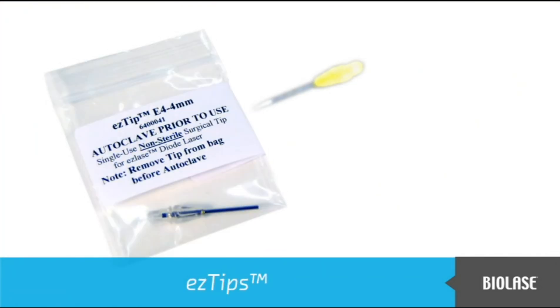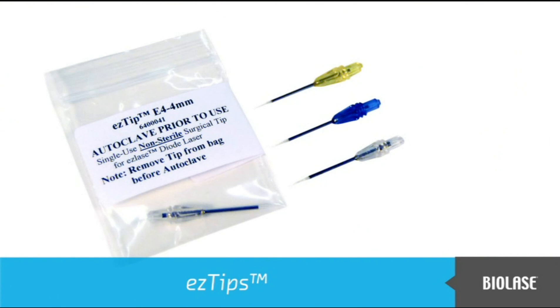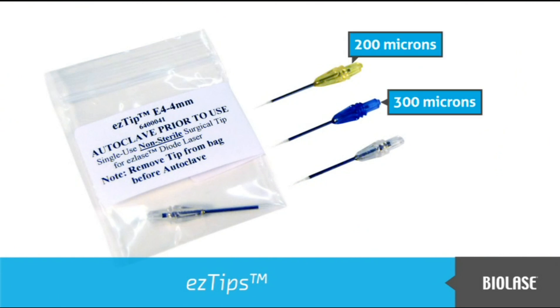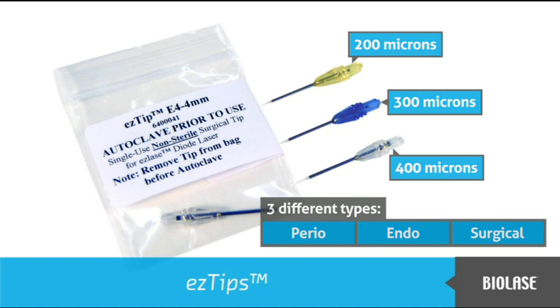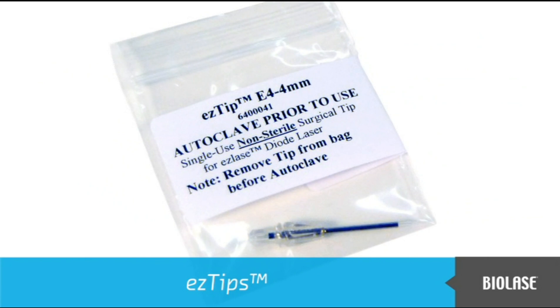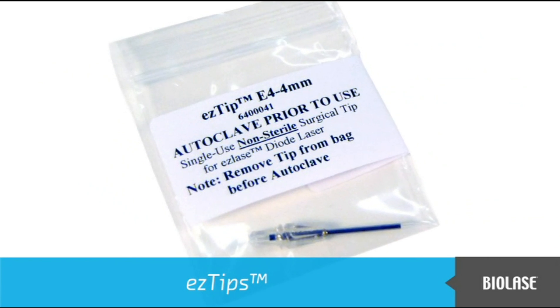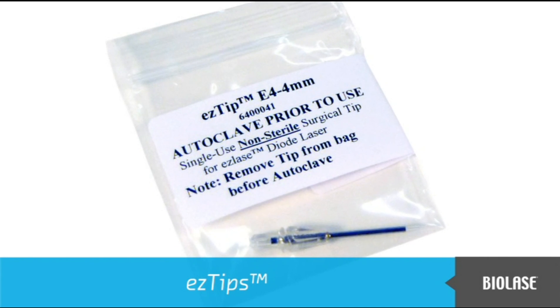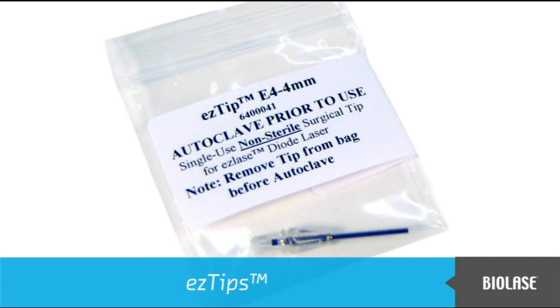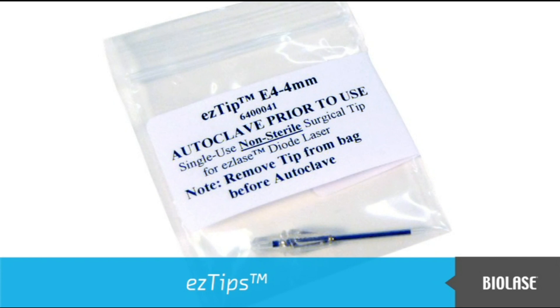Non-sterile tips for the iLaze are available in three diameters — 200, 300, and 400 microns — and come in three different types: perio, endo, and surgical. The tips are not sterile and the packaging is not suitable for autoclaving. You should sterilize your tips in an autoclave prior to use. You will find recommended cleaning and sterilization specifications in the user manual.